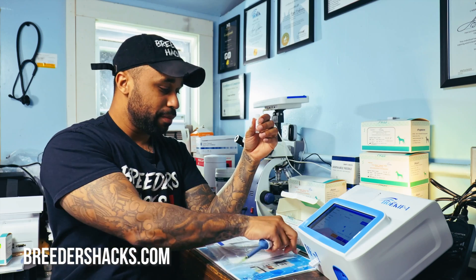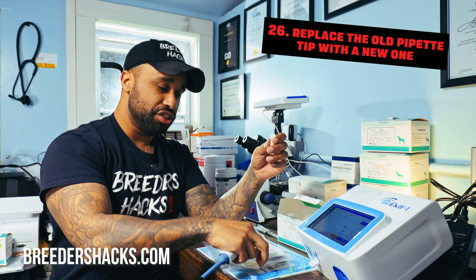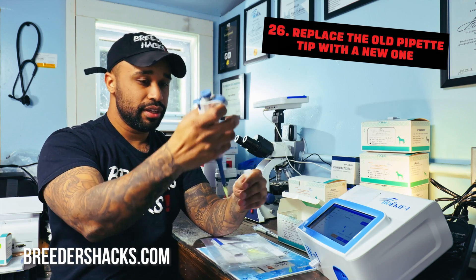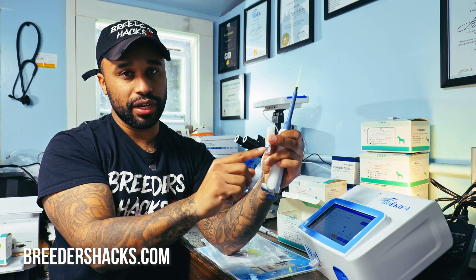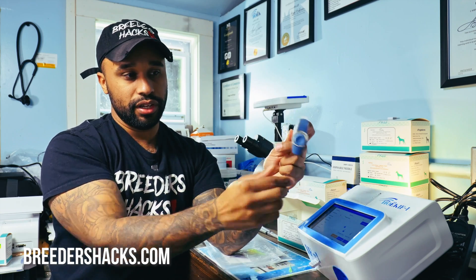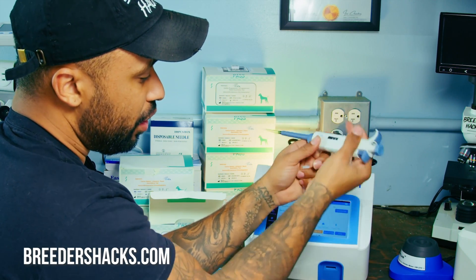Once that's done, go to the vortex mixer — press down and it evenly mixes the serum and buffer solution. Do that for about three seconds. Next, eject the old pipette tip using the eject button and put a new pipette tip on. Now instead of 50 uLs, we need 100 uLs of the serum-buffer solution we just created. Twist the pipette all the way to the number 100.